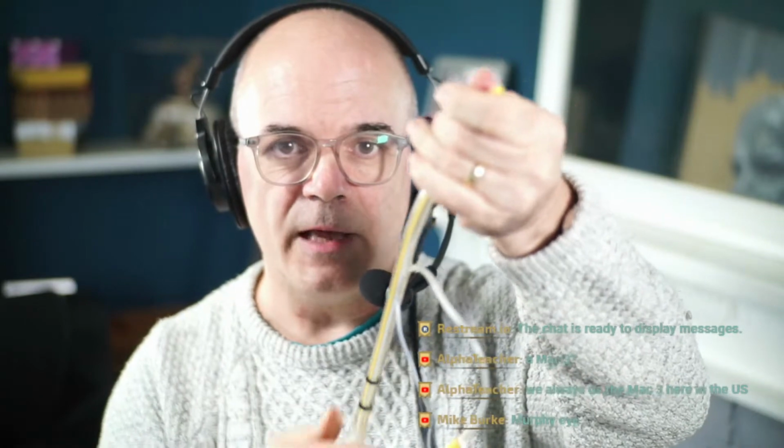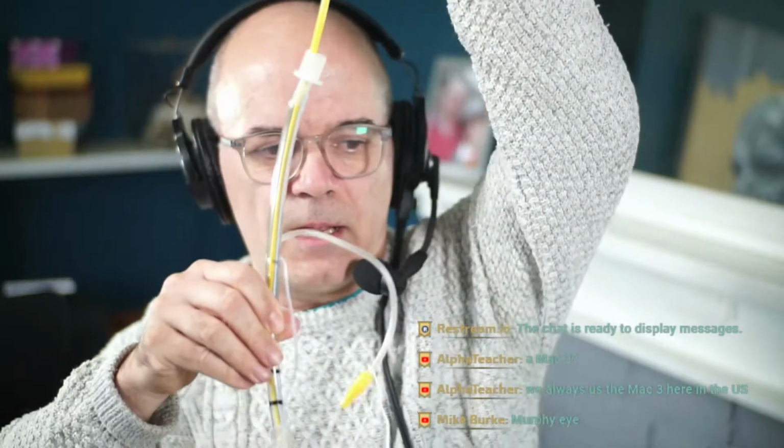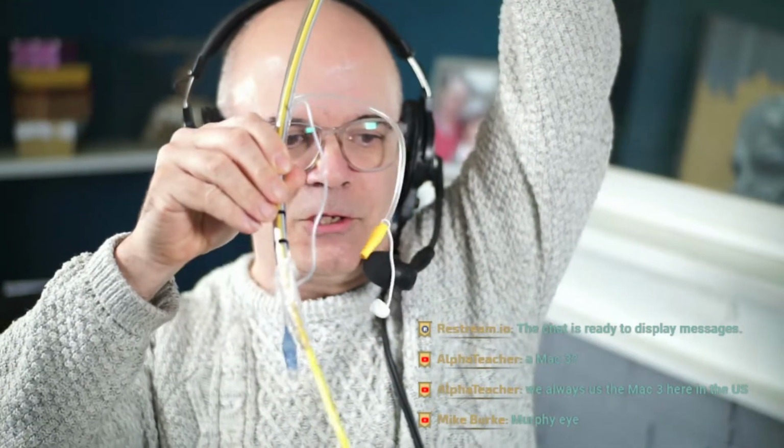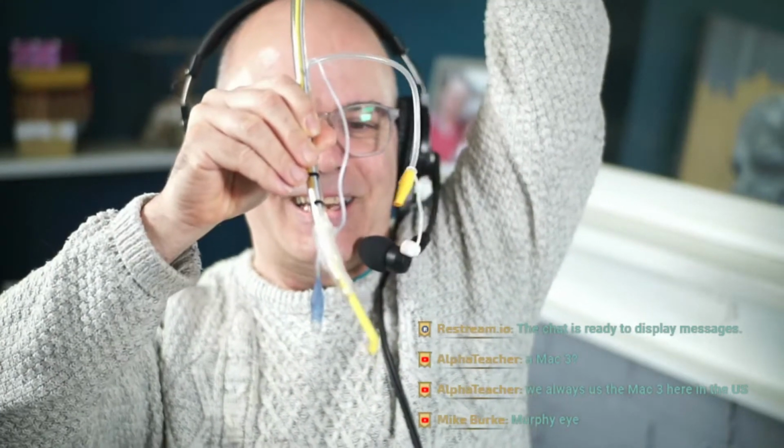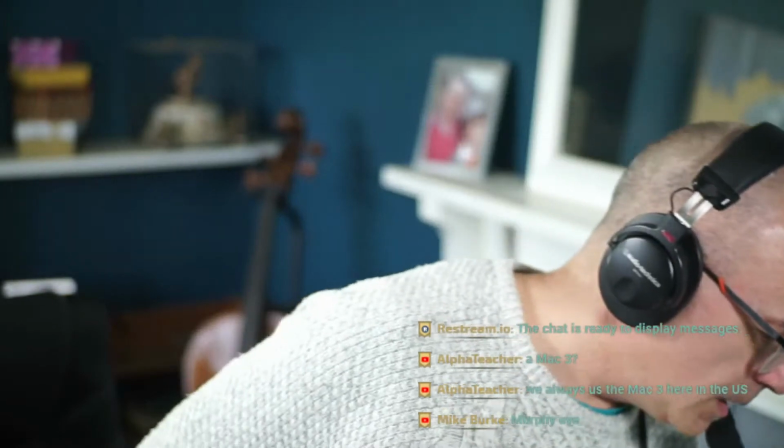So he can let go of it then, and he's just going to twist it and put it in, and hopefully eventually, if I can get it in shot, I'm not tall enough, he's going to eventually just feed that over the bougie and through the cords, and then he'll say bougie away. You take the bougie away, and hopefully that is the patient intubated.